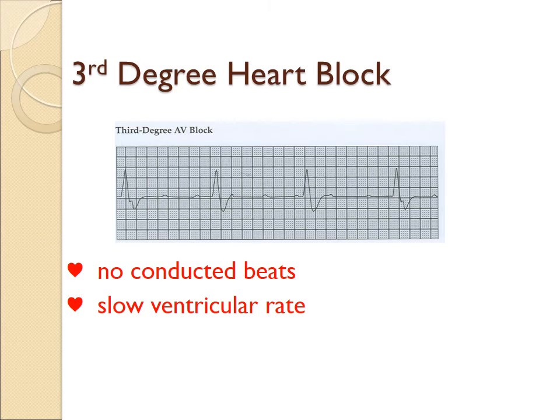In third degree heart block, on the other hand, we have the P waves being sent. The pacemaker just continually sends out the P wave, that conduction, but it's not getting through. And so the ventricle then has to start its own pacer, and you're going to see them functioning as if they're totally different. You can see this if you count out the P waves all the way across. They go the equal amount all the way across, and the QRS goes an equal amount across. But there's not a P wave in front of every single QRS in the same way.